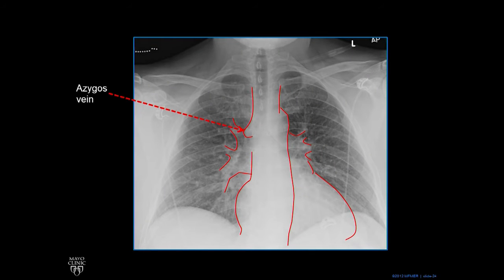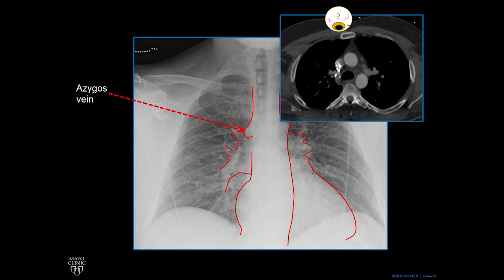Next we look at this little bump — that's the azygous vein. It's a vein that runs superior and inferior, and when it reaches, it comes over the bronchus and drains like a little arch straight into the SVC. So if we're looking from the front, we see that little bump there, which is why we see it on a chest X-ray. And it drains from the back.